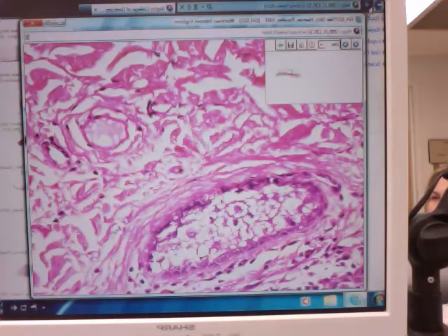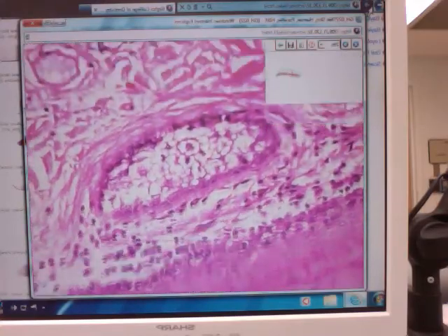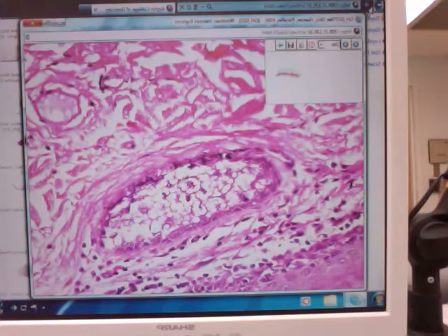Now, how do we know that's a sebaceous gland, not something else? One, next to a hair follicle, if the hair follicle is sitting there. But number two, what I want you to look at is each individual cell itself. This is a gland where you see individual little droplets. Can you see the borders, the outline of what I'm describing here? Each one of these things is a little oil droplet of sebum. So I always tell people, because I'm all about food, this is kind of like a fried egg. Here's the nucleus in the middle where the yolk would be. You got all this greasy stuff all over the egg.